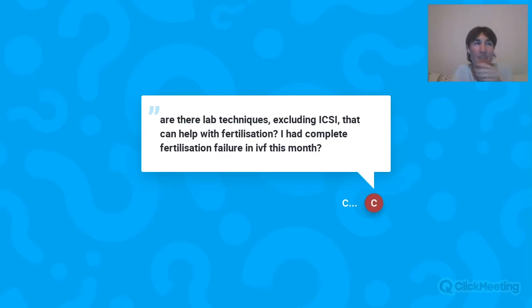And I remember a patient in this situation when we retrieved sperm cells from the testicles through a testicular sperm extraction. We actually managed to have a higher fertilization rate, and the patient is pregnant and had a baby. So we would need to know your specific case, and maybe it would also be a candidate for calcium ionophore treatment.